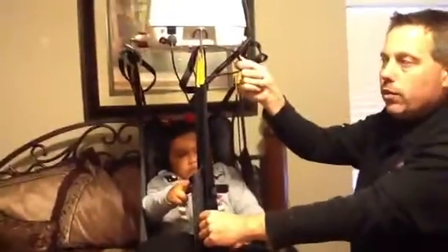What I'm going to show you here is that obviously we're on the yellow right here, but if I were to have put this on the black, what that would have done is lowered her legs and brought her to more of a seated position. So that's just one thing that would happen.